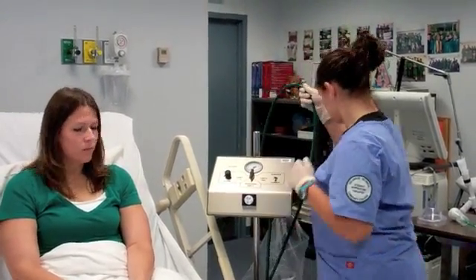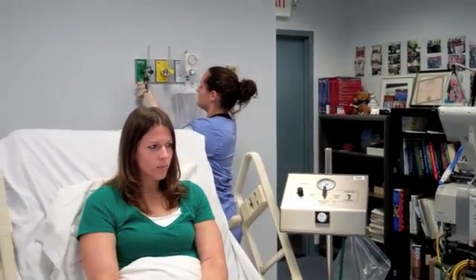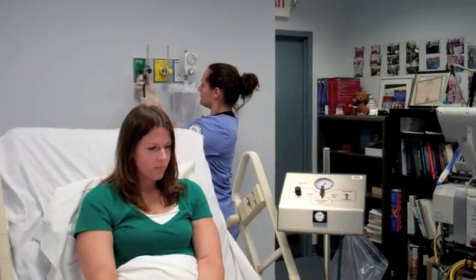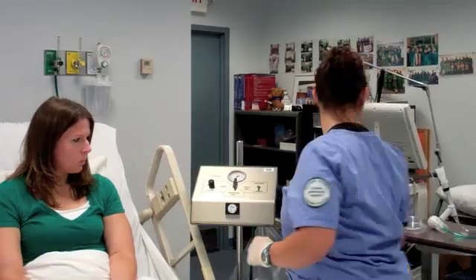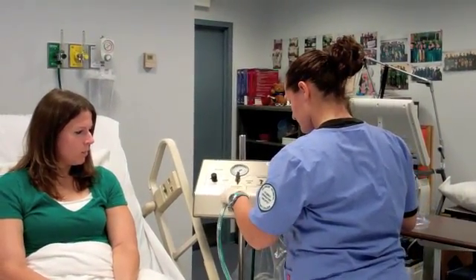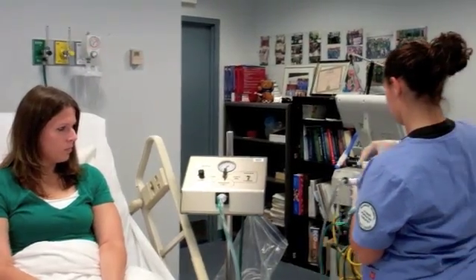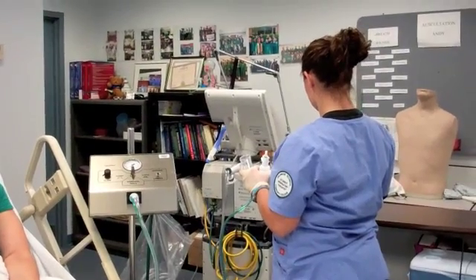First, you want to plug the machine into the O2 outlet on the wall. Then plug the circuit wires into the machine — it only goes in one way, so turn to the left and click it into place. Next, empty your medication into the nebulizer. If you are using an Aeroclipse nebulizer, make sure you have it set on the continuous flow setting.